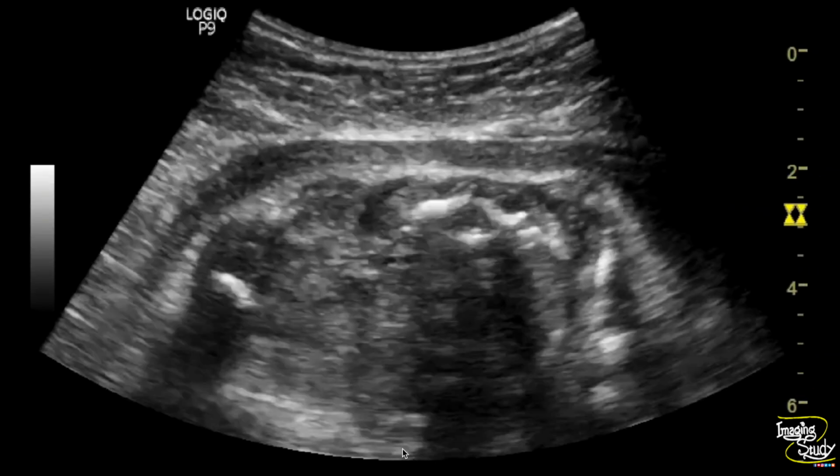Now let's look at the transverse section. I know a lot of people can't understand the transverse section of spina bifida. If you are a person like me, let's look here. This is the vertebral body and this is the posterior arch. And just look at the posterior arch. This is the site for the spinous process.